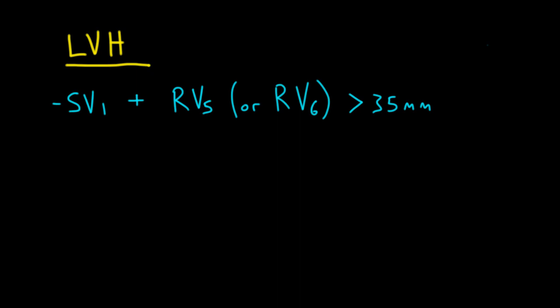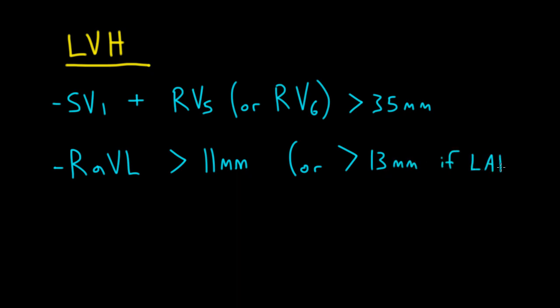With LVH there are a number of diagnostic criteria, and it's helpful to memorize at least two. In addition to the precordial lead criterion, a useful limb lead criterion is to look in lead AVL and see if the height of the R wave is taller than 11 millimeters. Lead AVL gives us the best view of the left side of the heart in the frontal plane, so with LVH the forces are more positive there. When you have left axis deviation, the threshold becomes higher — you'll need an R wave taller than 13 millimeters in lead AVL to call something LVH.